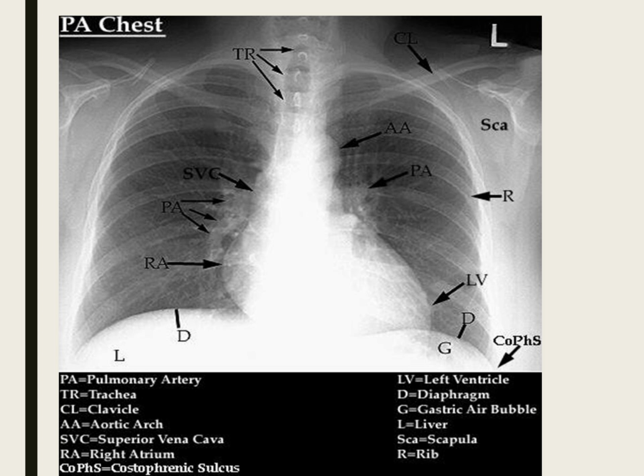We always want to see where the end of the endotracheal tube is. And where do we want it? Two centimeters above the carina, that's right.